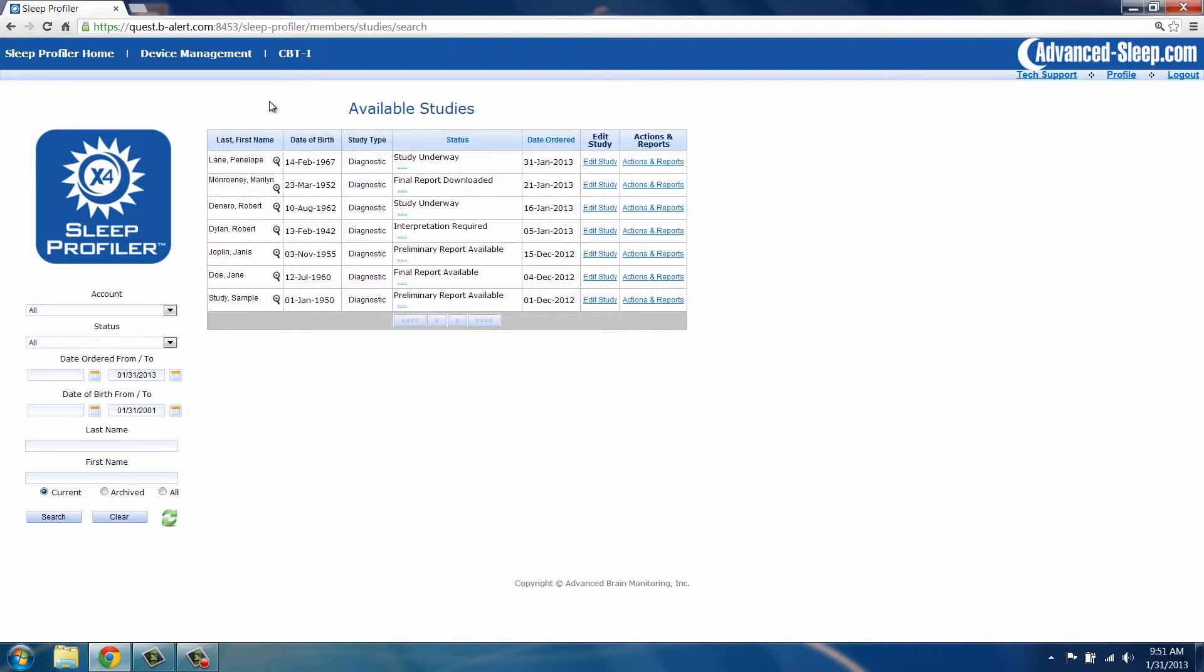Unplug the device. A voice message will indicate the device has been powered off. The device is now ready to be given to a patient and used to record a study.